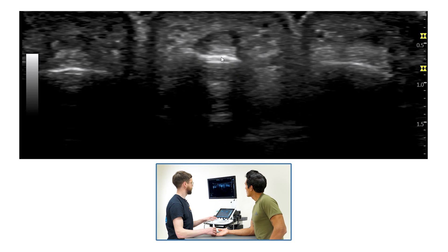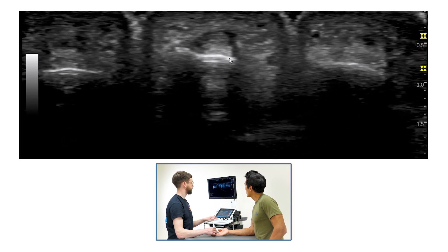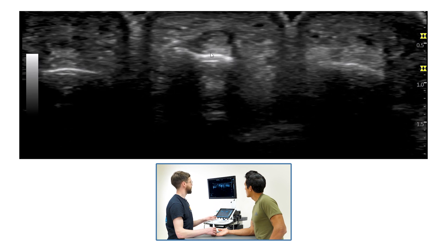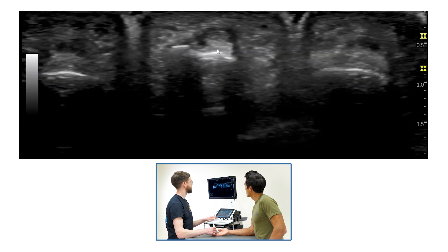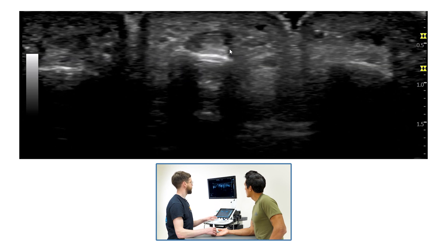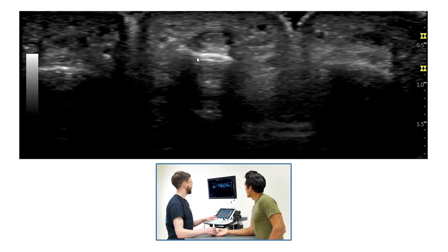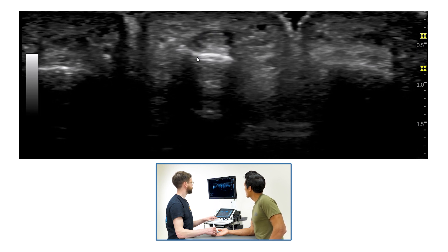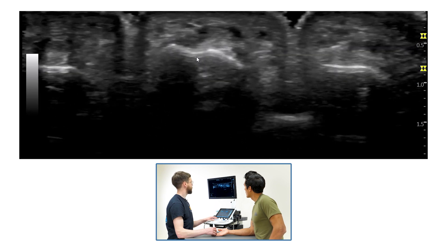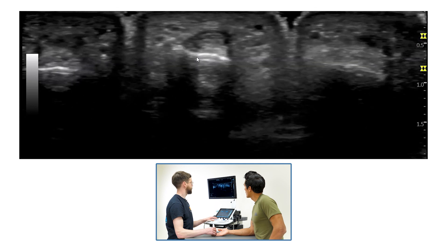What we can see here is a cross section of the bone of the middle phalanx, with the flexor tendons in the middle. If you wiggle your finger we can see them slightly shifting, and then what we can see over the top is the A4 pulley. We can then shift slightly proximal and slightly distal to observe the pulley along its length.